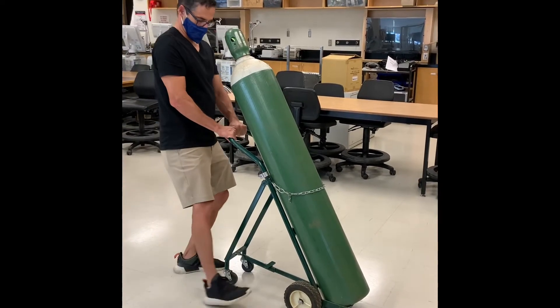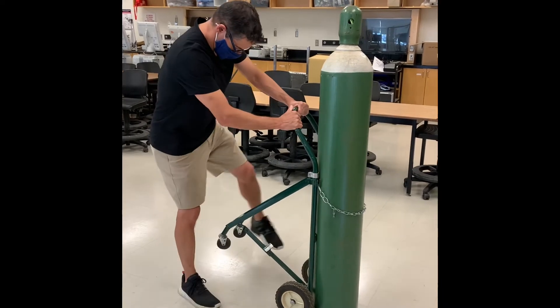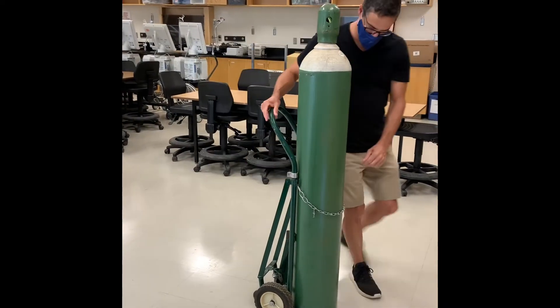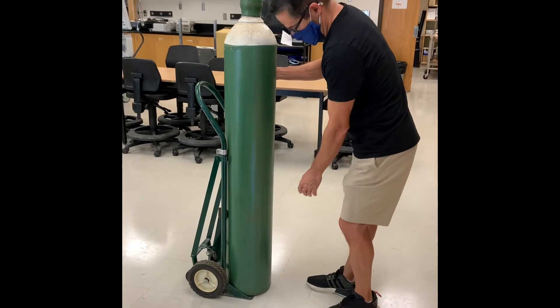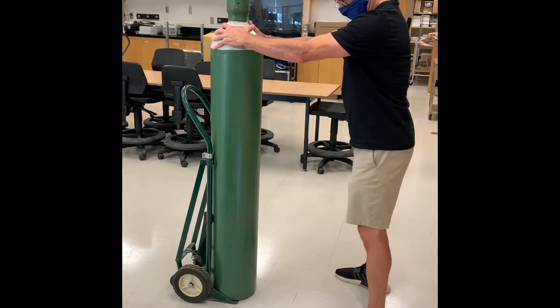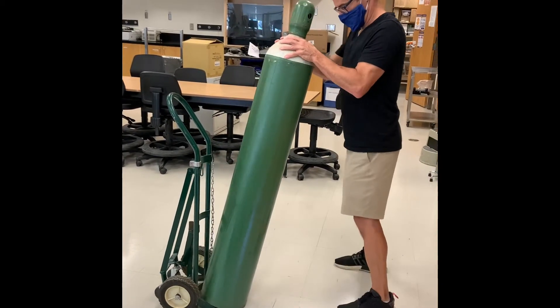Once you reach your destination with the medical gas cylinder, you can either leave it in the hand cart or take it out. I'm going to show you how to take the cylinder out and move it around by hand. Stand up the hand truck, remove the chain that is holding the cylinder in place, put two hands on the shoulder of the cylinder, and keep your feet about shoulder width apart. Tilt the cylinder towards you.